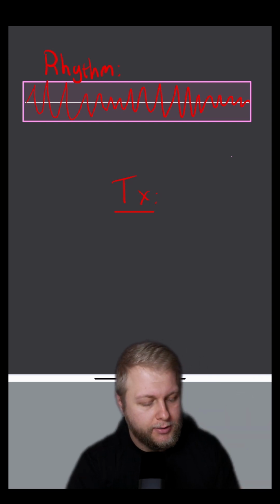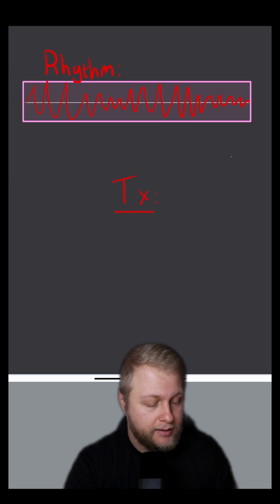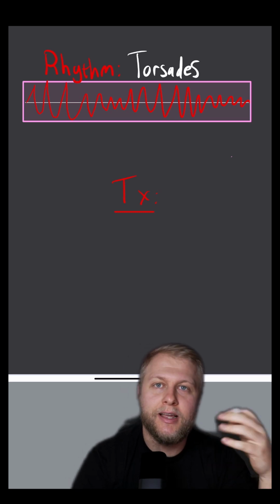Torsades, right? So this is called torsades or torsades de pointes. Now, what does that mean? It means the twisting of the points. Torsades. So, what is the difference between torsades and something like VTAC or VFib?